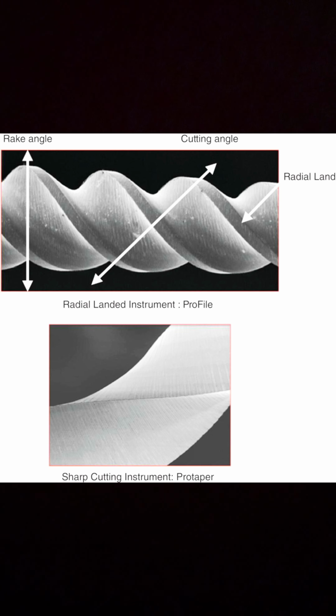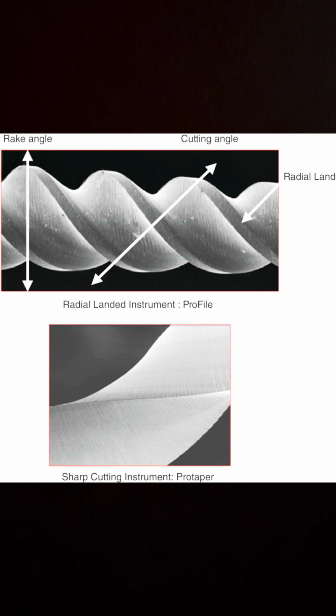Classification of endodontic shaping instruments based on the method of use. Group 1, hand operated endodontic instruments. First one is barbed broach. Broaches were the earliest endodontic instruments used to extirpate the pulp and enlarge the canal.